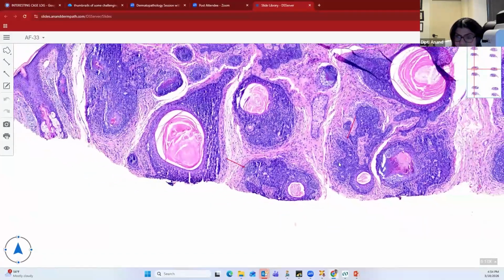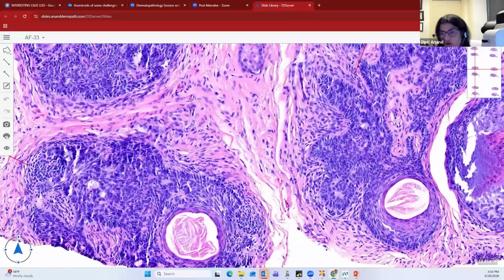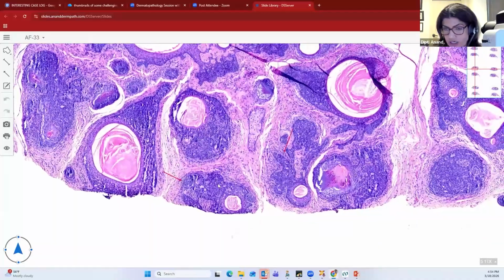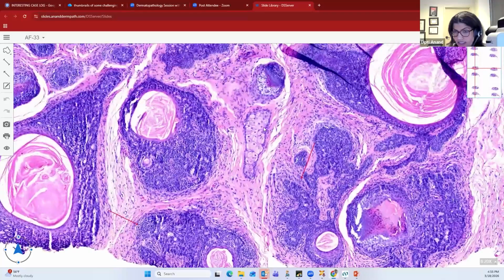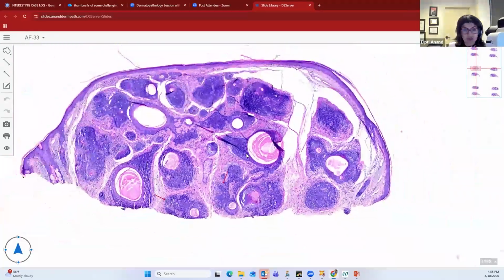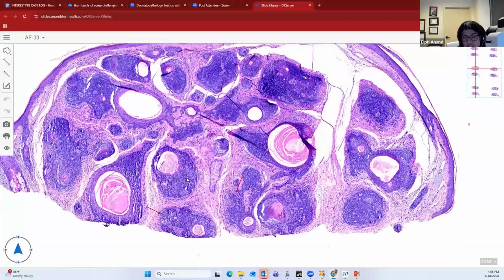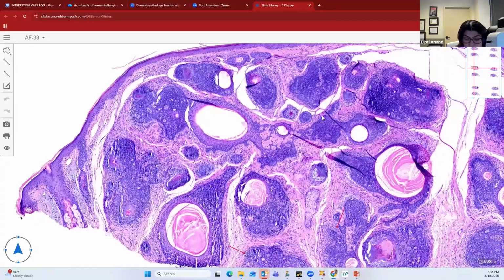The papillary mesenchymal body doesn't mean anything much. It basically tells you that this lesion is derived from a hair follicle and that it is a benign follicular tumor, and it is not something like a basal cell. And it is derived from the immature portion of the hair follicle. So these are all your basaloid follicular islands. A couple of them are showing papillary mesenchymal bodies. There are scattered horn cysts within the lesion. They're not as many as what you would see in a trichoadenoma, but they are there. And you can see the nice stroma of the lesion, which is nicely pink, and it shows nice retraction from the adjacent stroma. So stroma to stroma retraction is important in a trichoepithelioma.